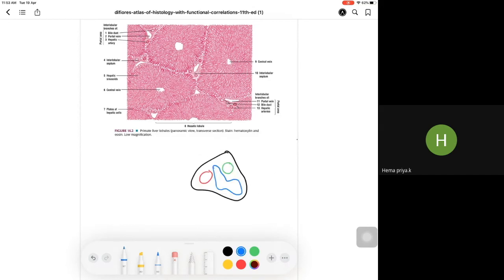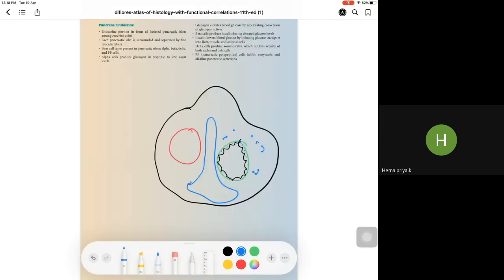As I told you, when the lymphocytes are confined within the portal triad, what do you call it? Chronic hepatitis. And when they spill over into the lobules, this is chronic hepatitis with activity. Because of the neutrophils in the portal triad, can you call it cholangitis? The neutrophil has to come and attack the biliary epithelium. Or what else will happen? Once they are in the epithelium, the inflammation is severe. What will happen next? They move into the space.